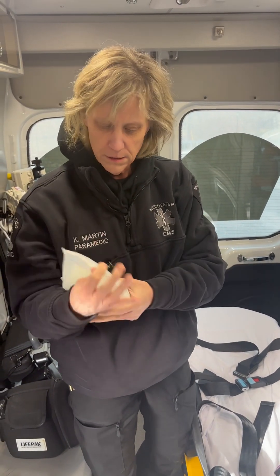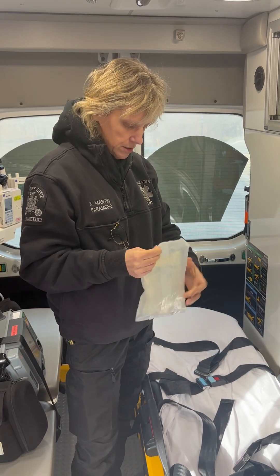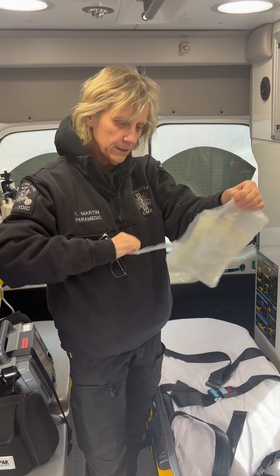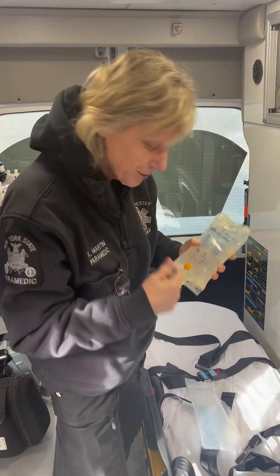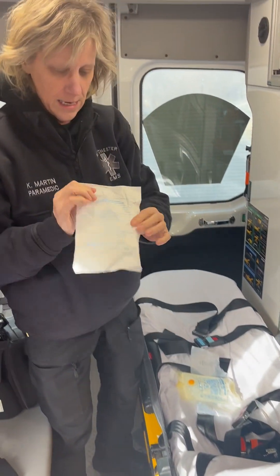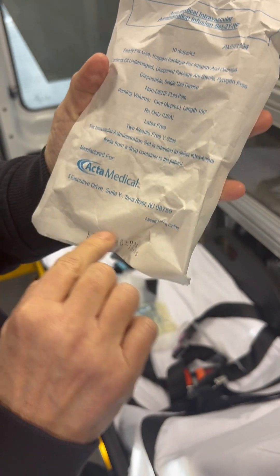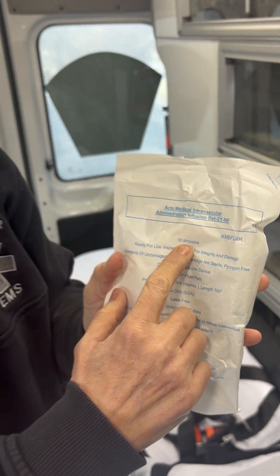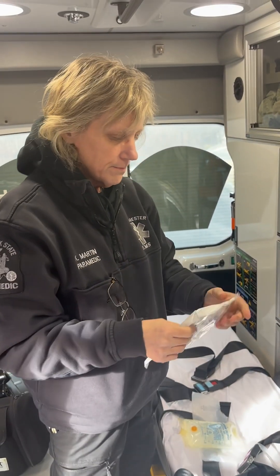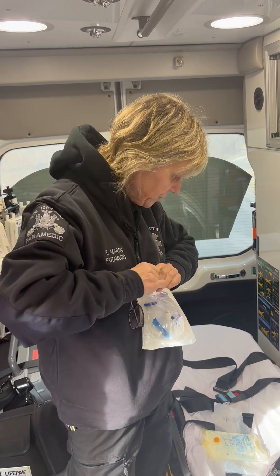So I got a 500 bag of normal saline right here. I'm going to open this up. The saline is super cold — like, we wouldn't normally put this in as-is.